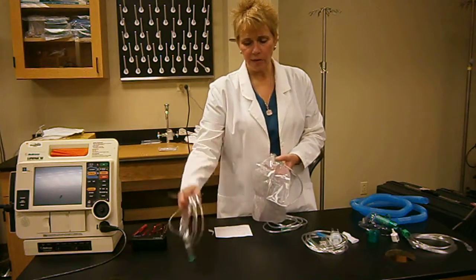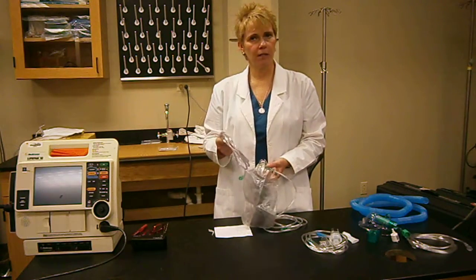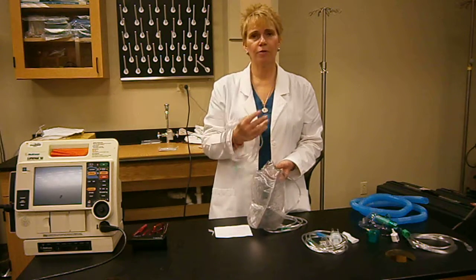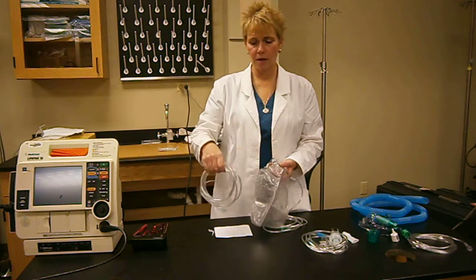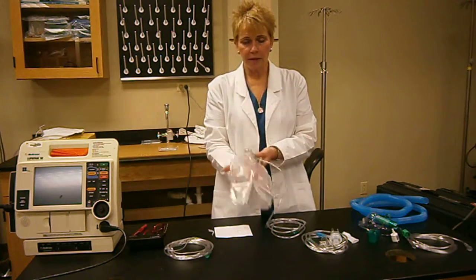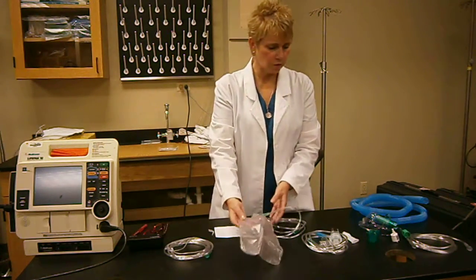With a nasal cannula, be aware that if a patient is a mouth breather, we're giving them oxygen through the nares, but they're not actually breathing it into the lung. It's also dependent on the depth of their breath. So again, the non-rebreather we would go to next.